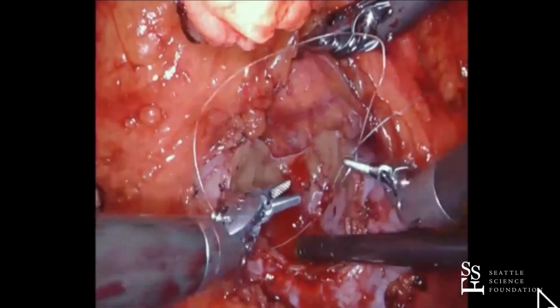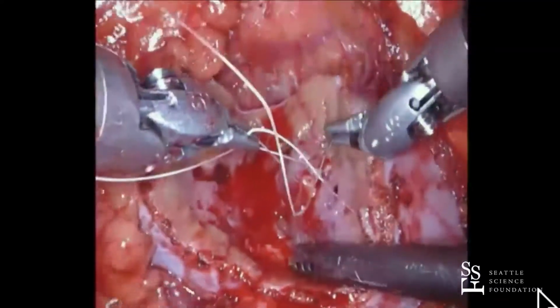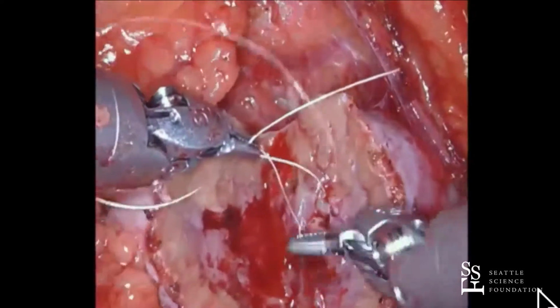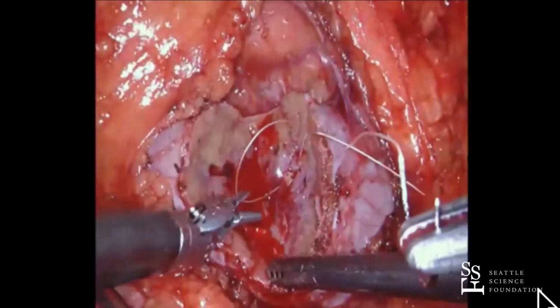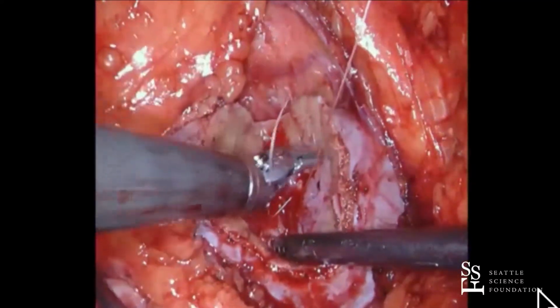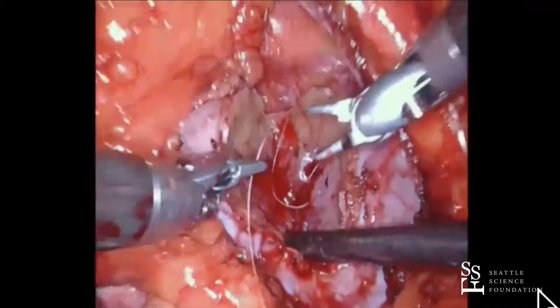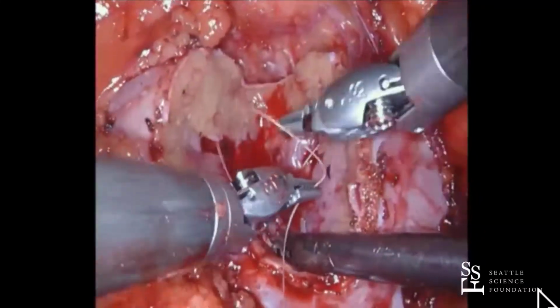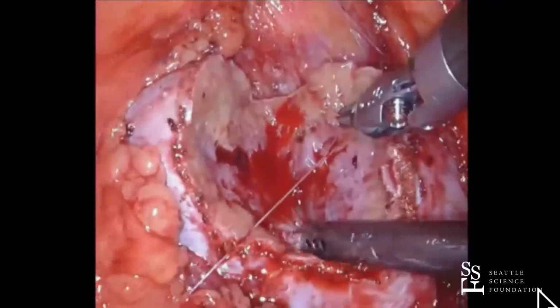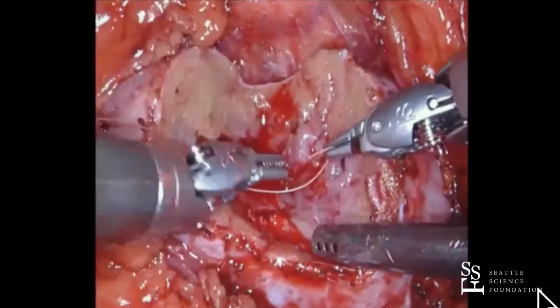Was this a suction fourth arm external collision? I'm sorry, Caden, what was the collision? Externally, good question. Brandon was being kind of, like I told you, sometimes that fourth arm can be a problem, and it can create a handcuff situation where he couldn't move. He couldn't really help me suck that much. So you brought it down inside, which brings it up outside.